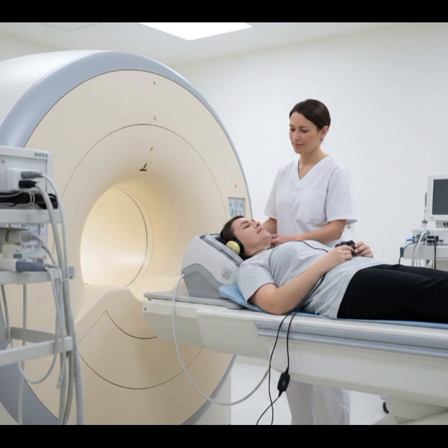Align the patient using the glabella as your central landmark, then slowly advance the table into the bore, making sure they remain calm and relaxed before leaving the room.